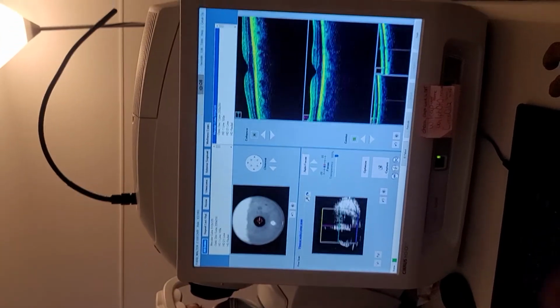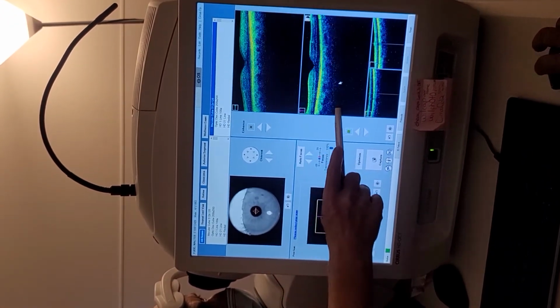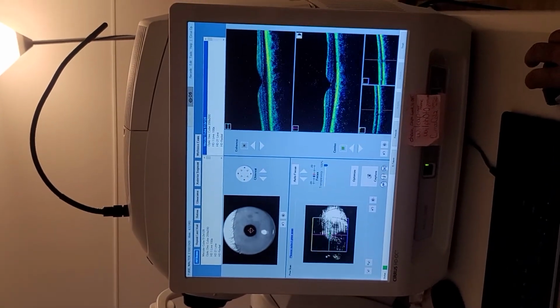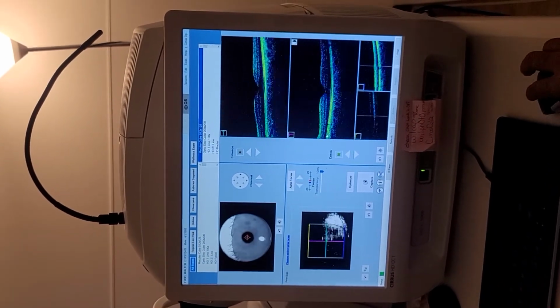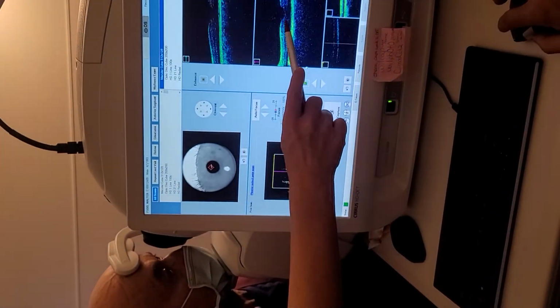You're not really seeing it, right? But you have your image over here, so move this down here. Okay, not too low. Bring it up a little bit. Okay, good. We can see this, that's clear, because you have your image over here.